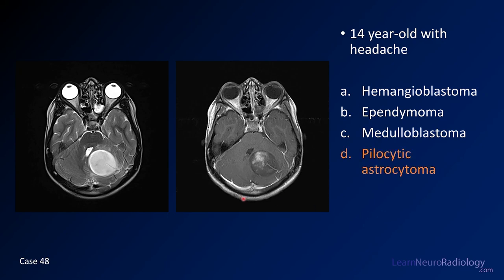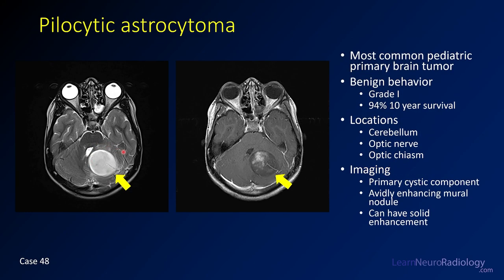This is a case of pilocytic astrocytoma. What you have is a teenager with a well-circumscribed mass in the left posterior fossa, some edema around it, some mass effect, and a little heterogeneous enhancement. If you see a posterior fossa mass in a child, the most common pediatric brain tumor is a pilocytic astrocytoma. These are relatively benign tumors with relatively good survival.